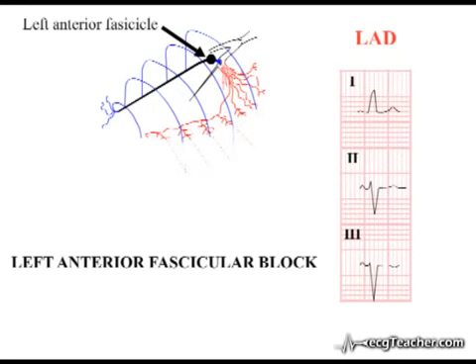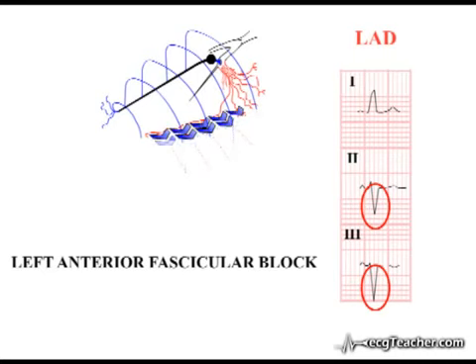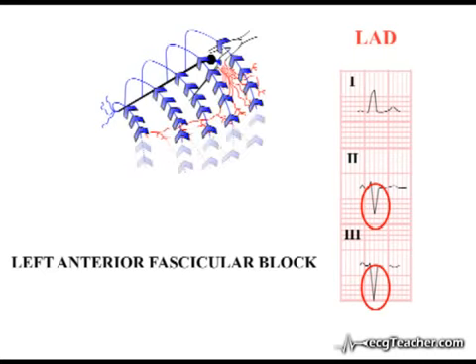In physical terms, the deep terminal S-waves observed in this situation in the inferior leads result from the retrograde depolarization of the lateral and anterior left ventricular wall. This depolarizing force is slightly delayed relative to normal and spreads upwards from the anastomoses in the lateral wall. As it is moving away from leads 2 and 3, a negative deflection is produced in these leads.